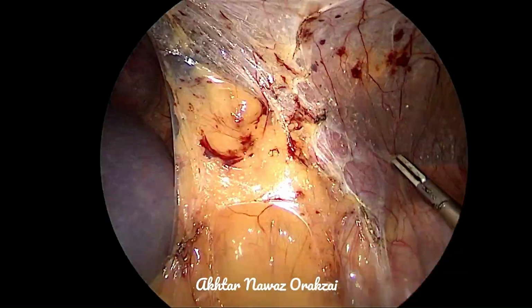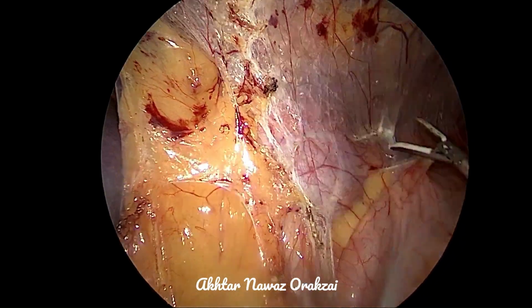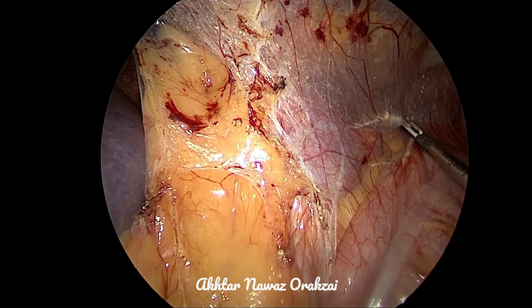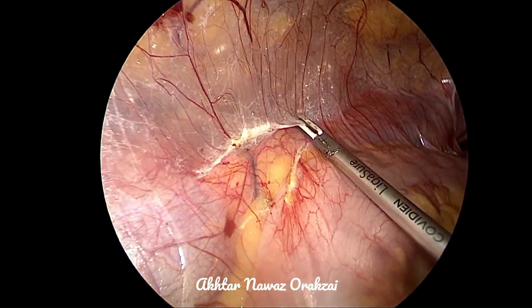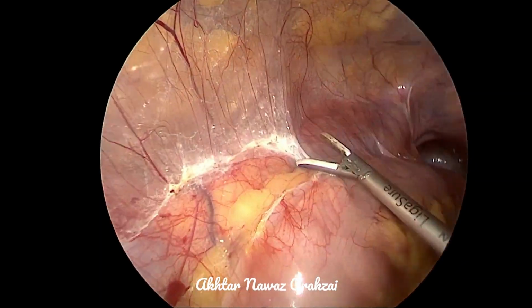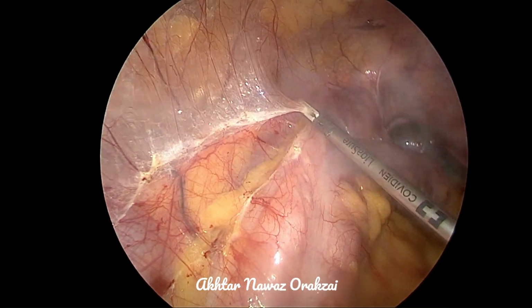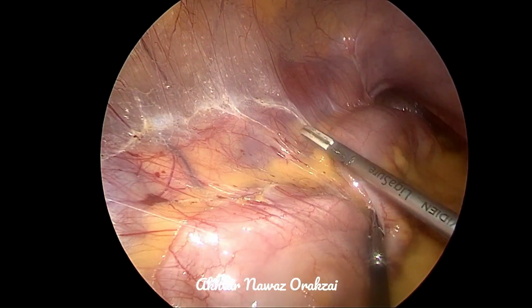The steps of again the pyeloplasty, the pyelolithotomy, ureterolithotomy, simple nephrectomy, radical nephrectomy, nephroureterectomy, as well as adrenalectomy are the same. So there is a mobilization of the colon, and on the left side we mobilize the colon up to the pelvic brim.